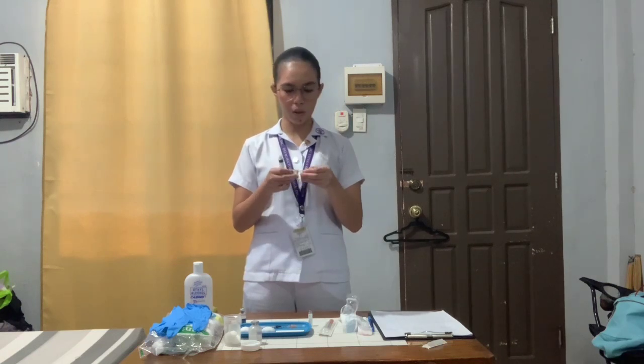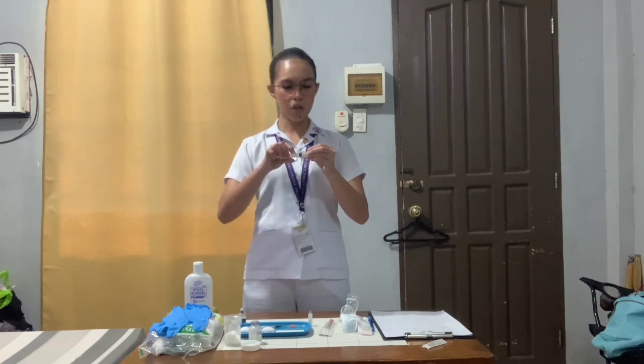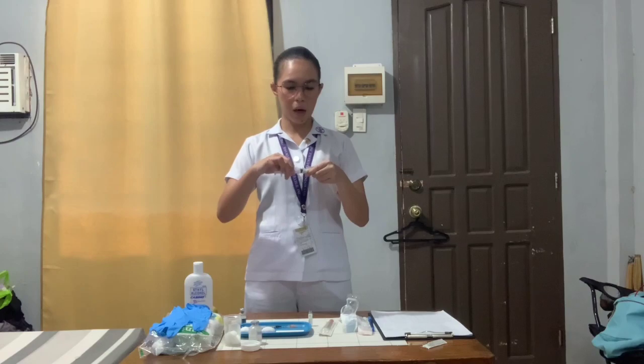So I'm just going to open this, and then attach the filter needle into the barrel. We have to ensure that this is firmly attached into the barrel.